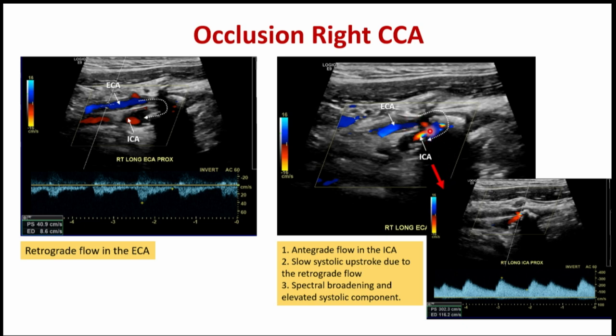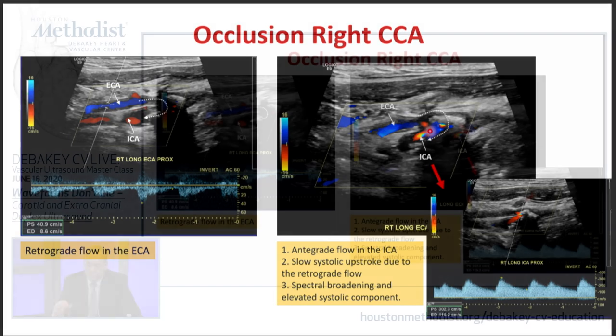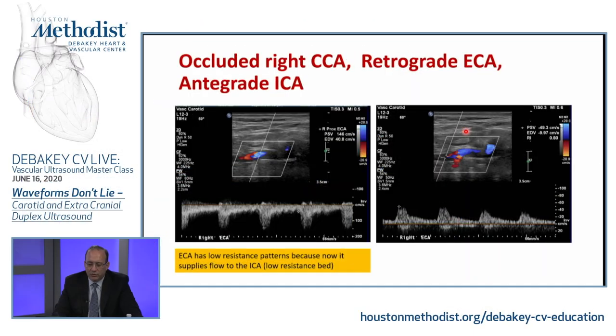And there's an area of stenosis somewhere in there, and that's probably at the site of the plaque, because remember, a plaque that's located in the bulb, it's not just in the bulb, it's really involving almost the origin of the internal and the external carotid artery, as we always see during surgery. It's very rare to see a plaque involving only the origin of the internal carotid artery and not somehow getting the external carotid artery to be involved too.